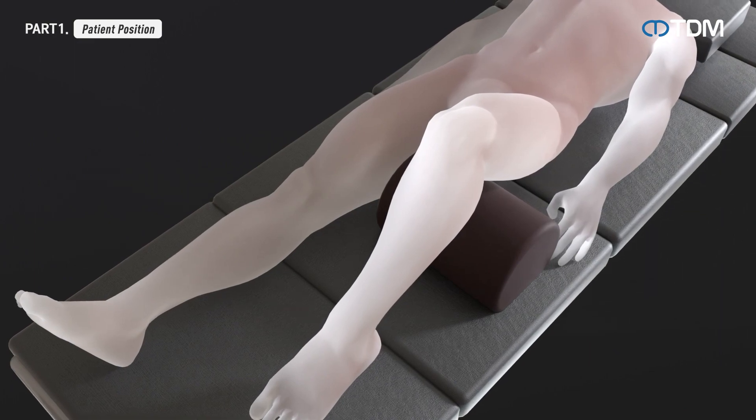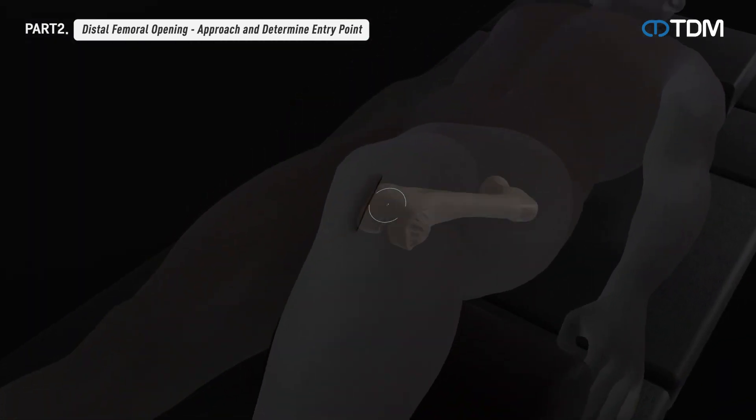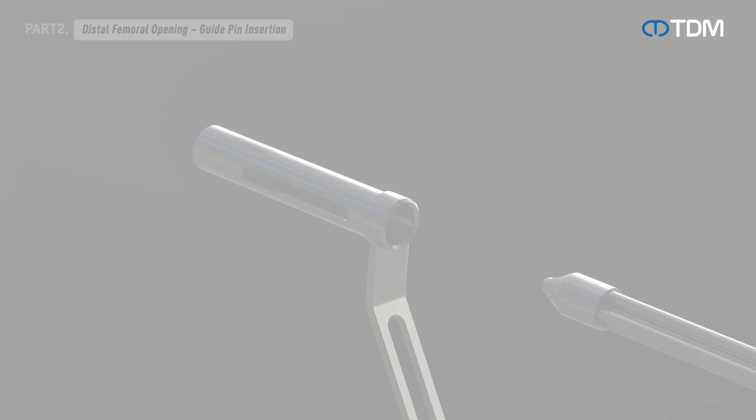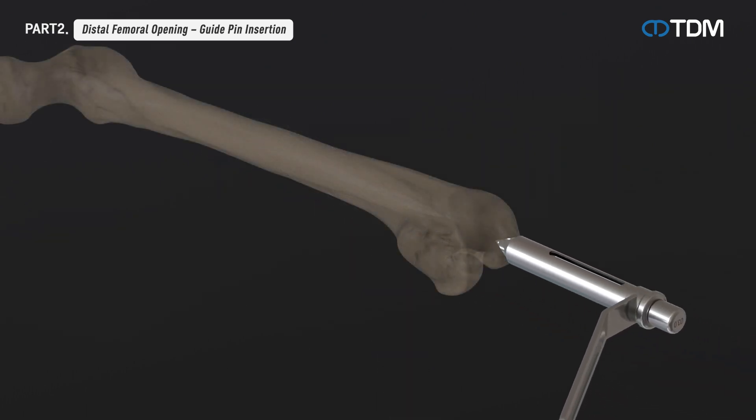Make an incision on the treatment area and place the guide pin in the center of the distal femoral cavity. Insert the instrument with the combination of protection sleeve, drill sleeve, and trocar into the incision to position the guide pin to be inserted.